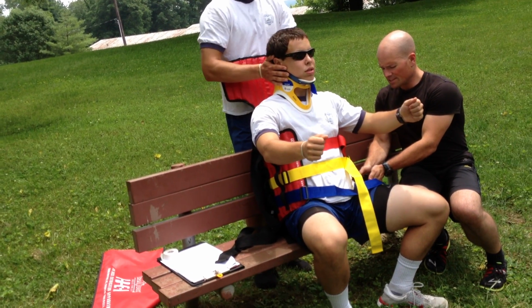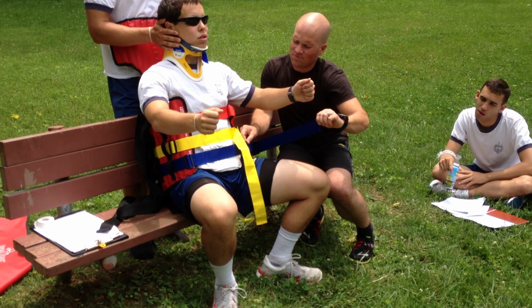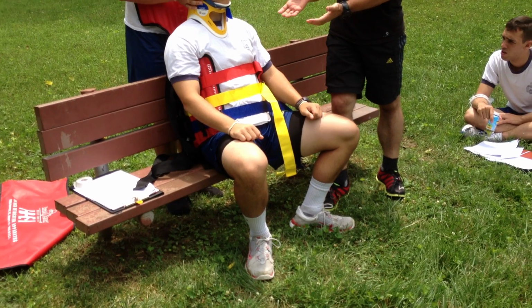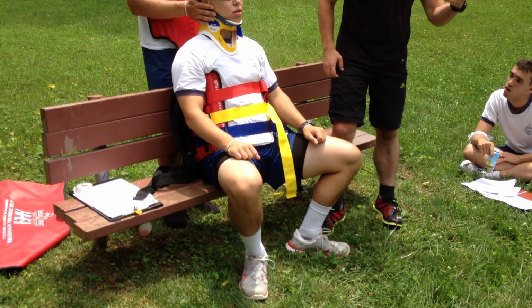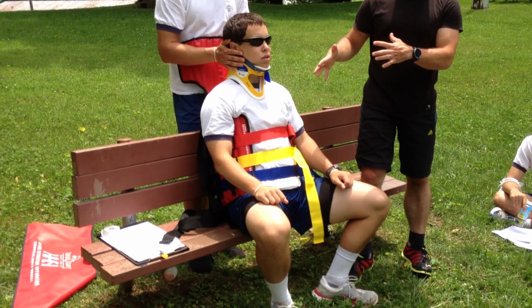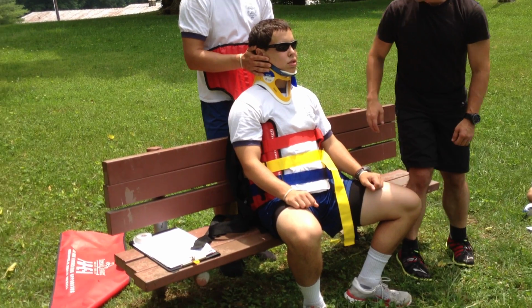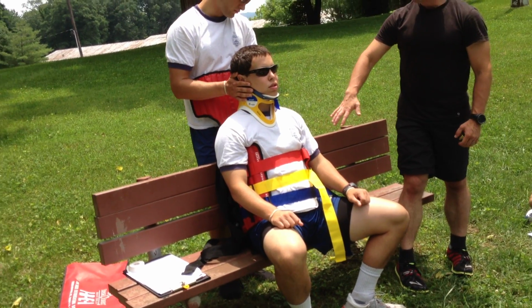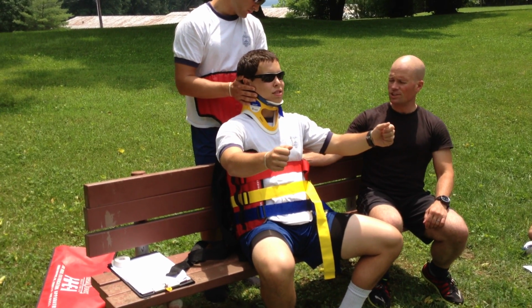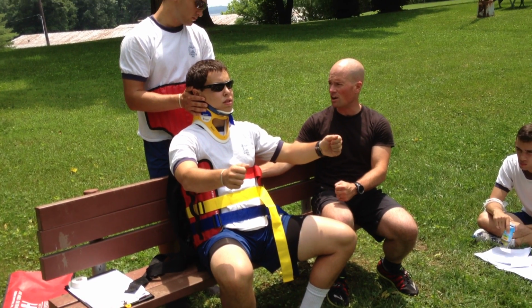But for this device, the main idea is that I'm going to position the device to stabilize the torso first. I'm going to do the legs second, and I'm going to do the head last. Pretty much the same idea as we were doing before. So when I'm looking at the torso, this device, hands on the steering wheel again, sir, has some handles here because eventually we're going to use this to haul the patient out of the car.